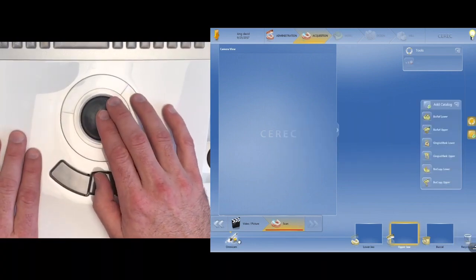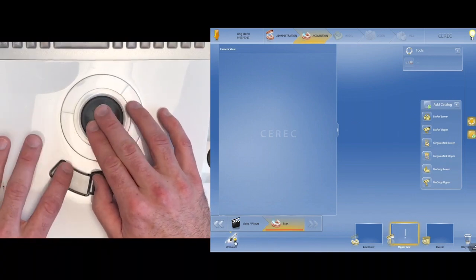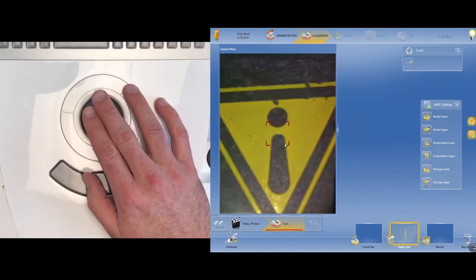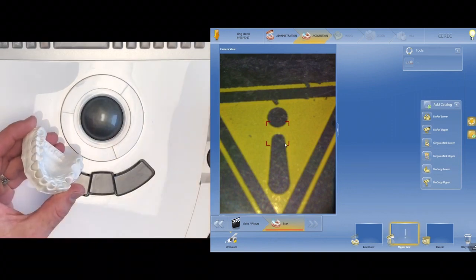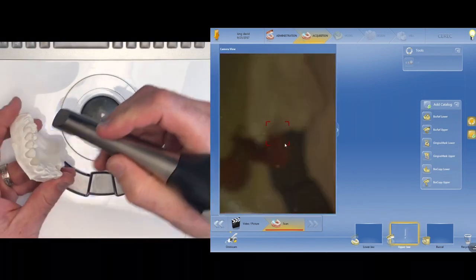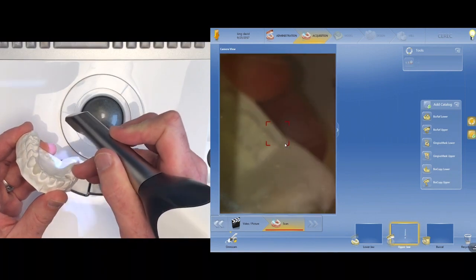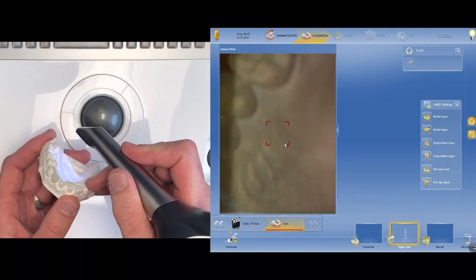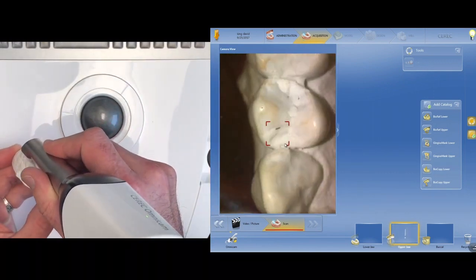And so we have a foot pedal where you lift your foot and it'll turn on the camera. Or you can just click here with your left button. Click that button there. Now the camera's active. I'm going to grab my model again and I'm going to pretend again it's in the patient's mouth. Lift up the camera. I'm going to hold it just like a handpiece. Then I'm going to grab my fulcrum right here. Whether it's one or two teeth, usually on the opposite side. Sometimes I'm all the way on the same side, but usually I want to give enough room because I'm going in the patient's mouth. So let it start to image.